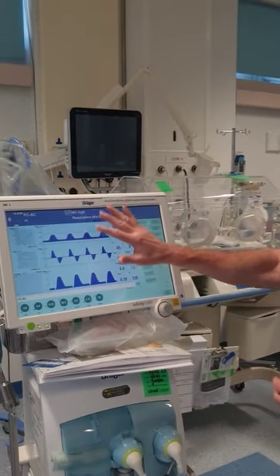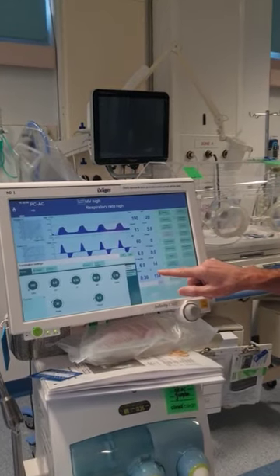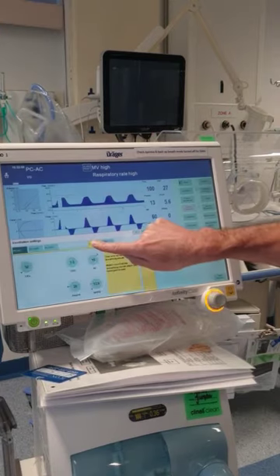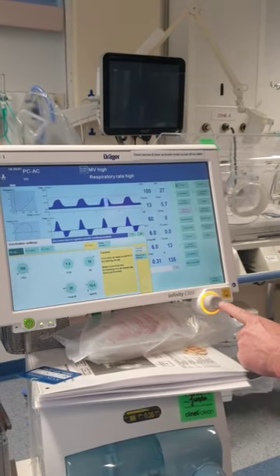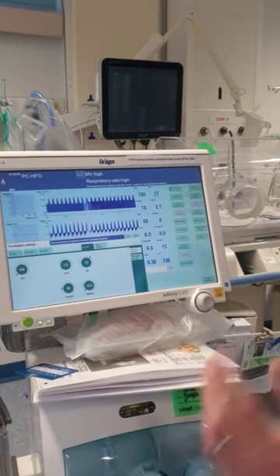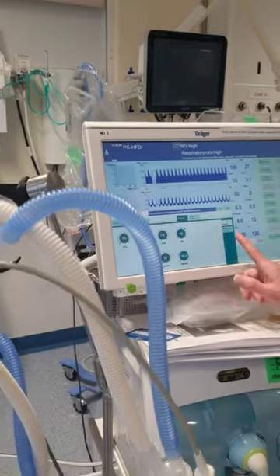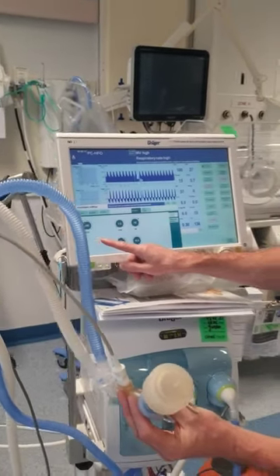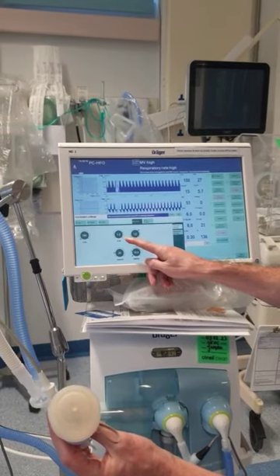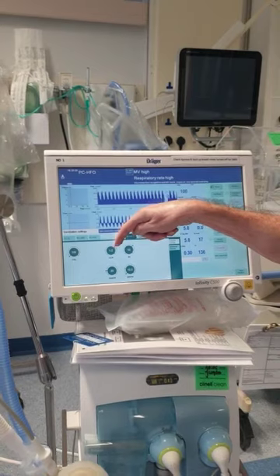It's very easy. So here's our standard screen, ventilator settings, and remember that mean airway pressure was 13. Then we press PC HFO, and we'll want to press there to start. And you can hear the machine jiggling. Now, this screen is up, and this shows us what we're at. We're on 100% oxygen. The IE ratio, inspiratory to expiratory ratio, in high frequency is set at 1 to 2. We don't need to adjust that.